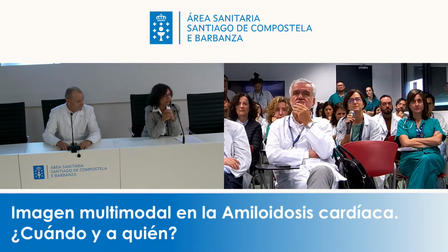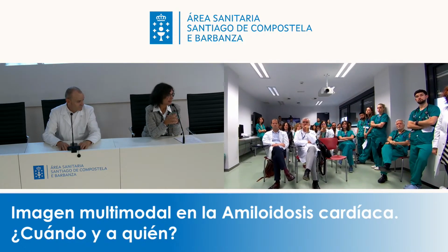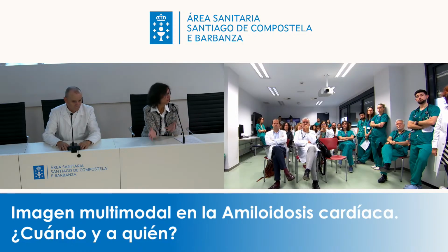En mi hospital, todos los pacientes con la sospecha hacen una resonancia. Es muy importante para el diagnóstico. Y como ha dicho, la resonancia la tenemos en nuestro hospital, pero no la cintigrafía.